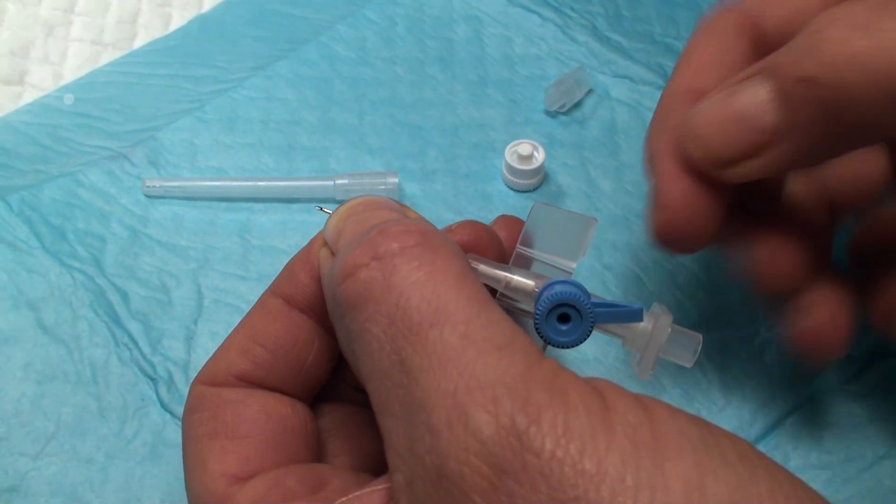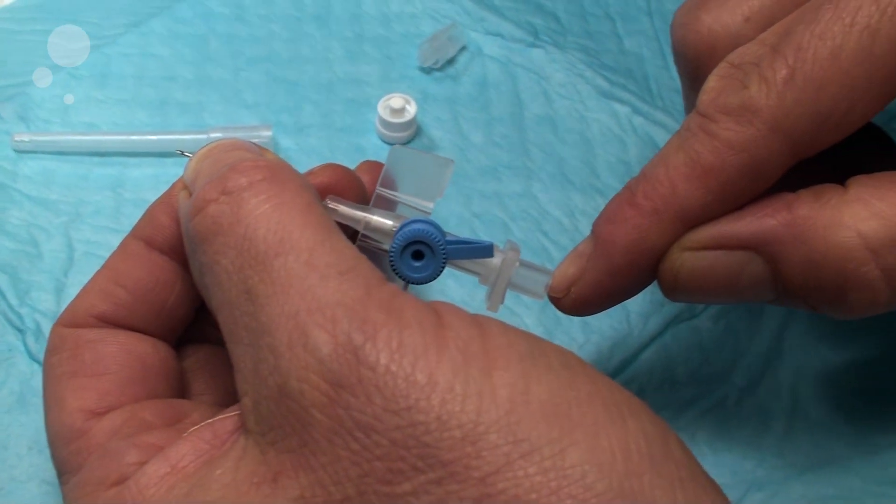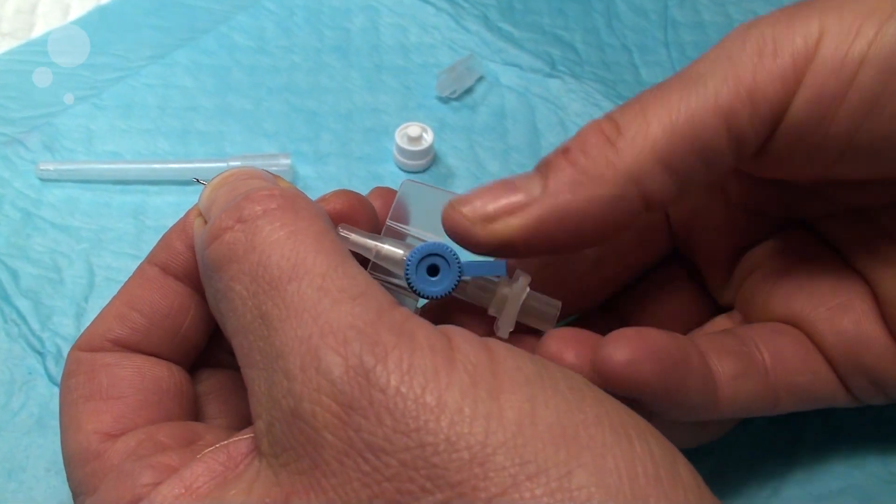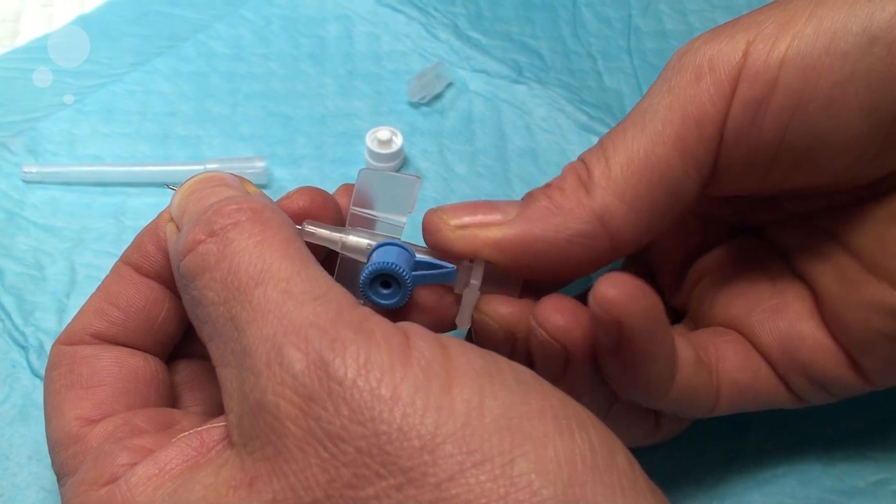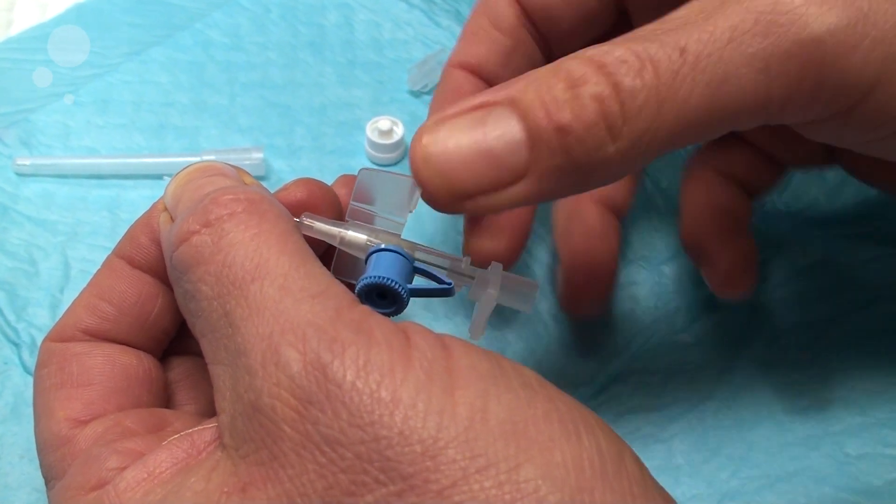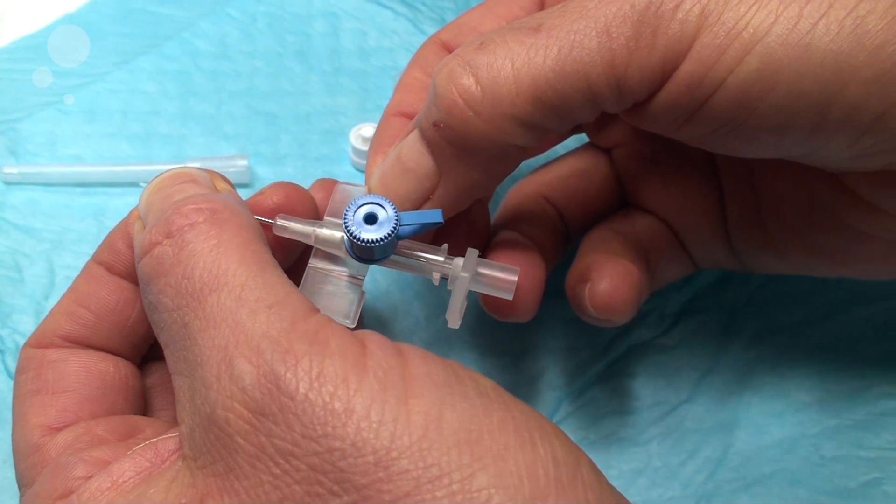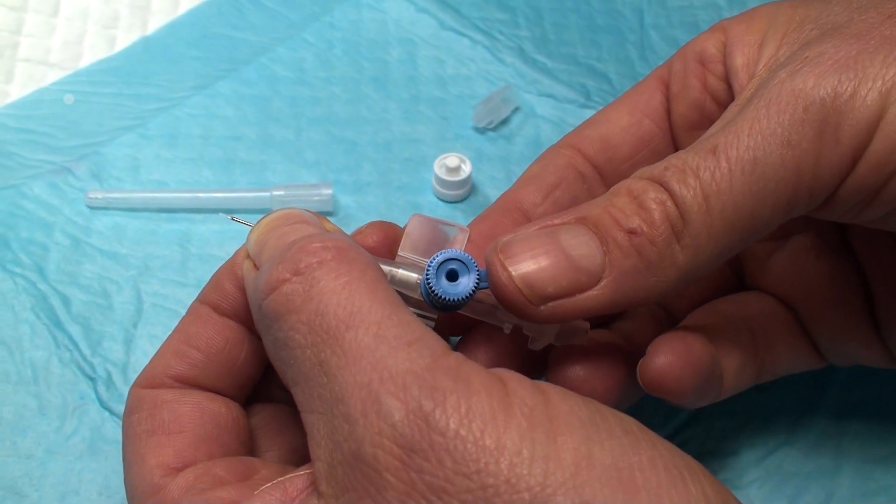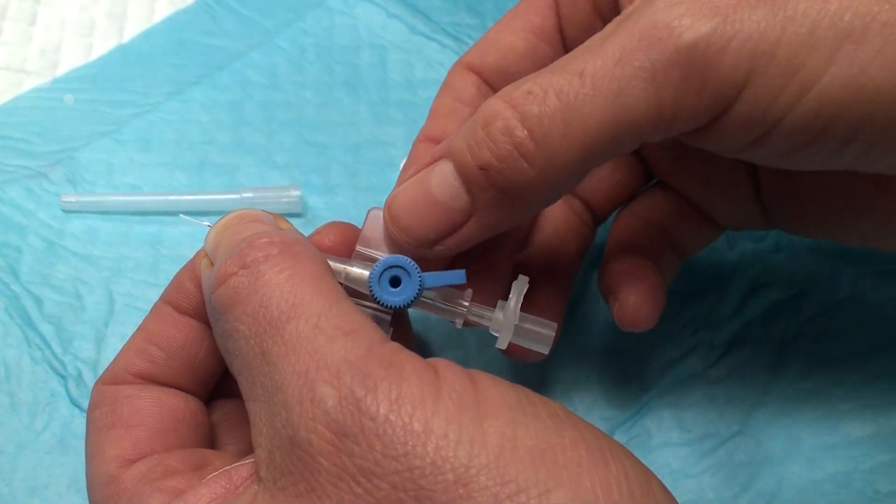When you are inside the vein, blood will come out at the base of the Venflon, and you will pull slightly back to have the soft tip of the catheter inside the vein. Then you can further introduce it, keeping the needle inside the catheter as you put it longer into the vein.